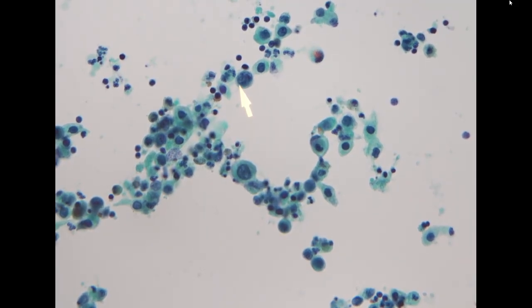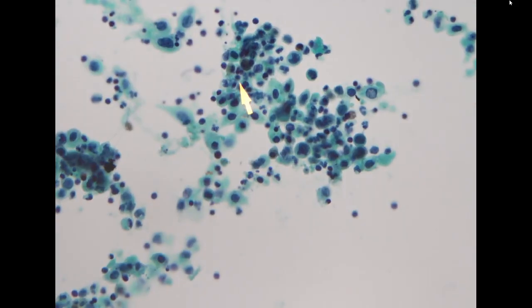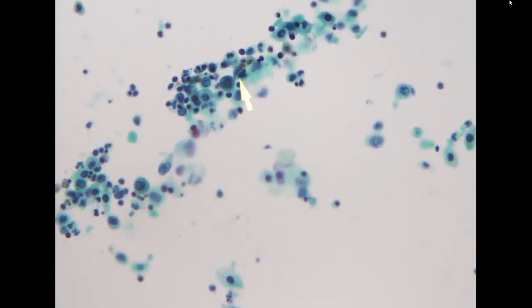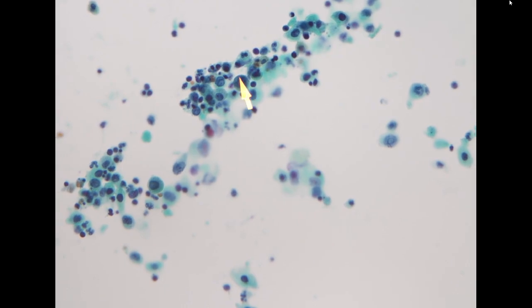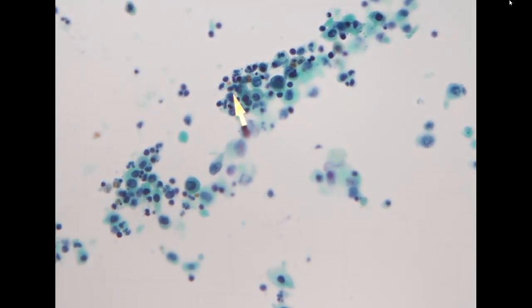I think there might be a little bit of small cell transdifferentiation, but the morphology is very difficult because most of the time small cell carcinoma has very high mitotic activity, some with prominent crush artifact. So it is very difficult to tell if this is small cell or not.